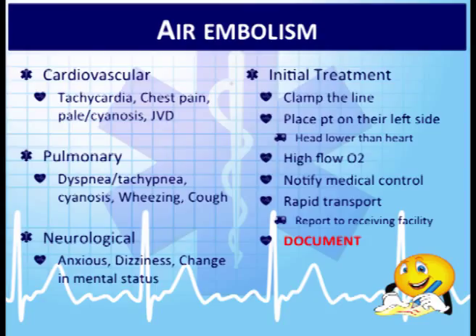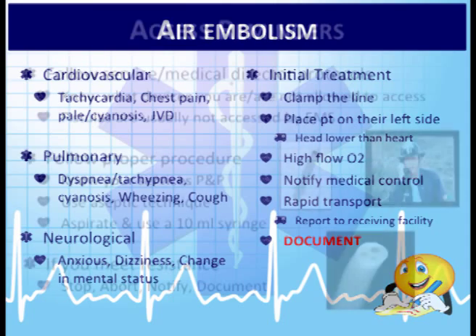What's our treatment if we think this is going on? We want to clamp that line, place the patient on their left side, high flow O2, let our medical director know, and rapid transport. And of course, we're going to document as we work with any other procedure.